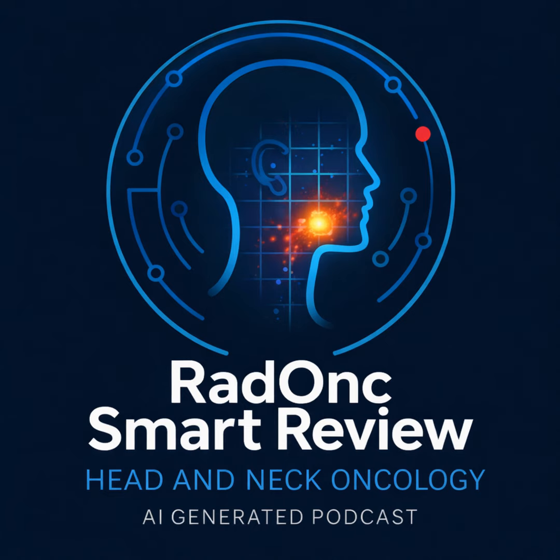Okay, moving to the imaging protocol, which directly informs our contouring. What's the bare minimum CT simulation requirement? We must have a CT simulation with 2 millimeter slice thickness. I wouldn't call this a recommendation. It's really a requirement for high-quality head and neck planning. And why is that? Thinner slices are just essential for distinguishing small nodal margins, especially in that level 2 region, and for accurately visualizing fine structures like the pharyngeal constrictors and the cochlea.